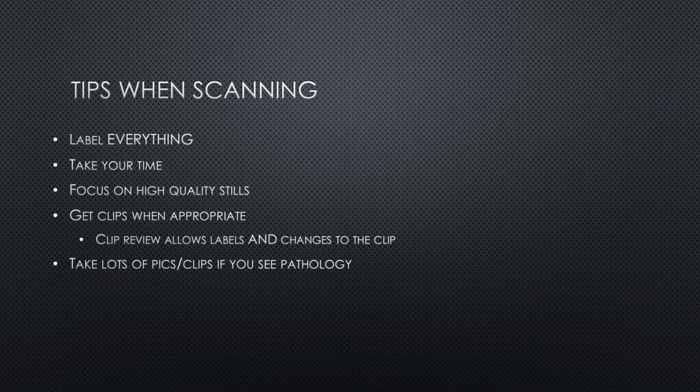If you see, especially if you see serious pathology, you should take more images rather than less, because that's sort of the right thing to do, right? You want to really show the pathology that you're trying to demonstrate.